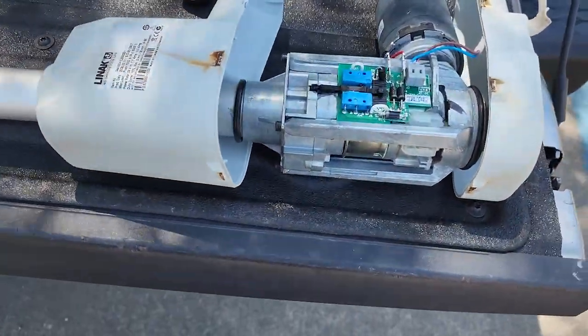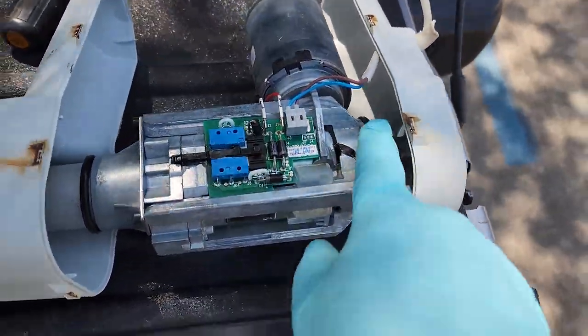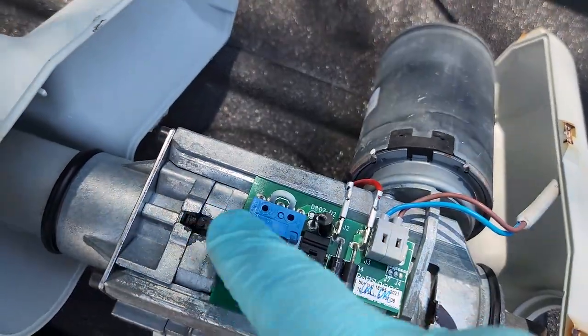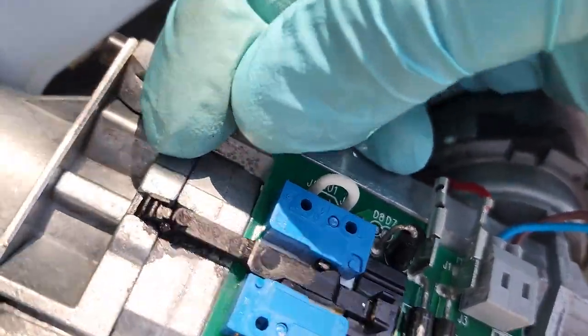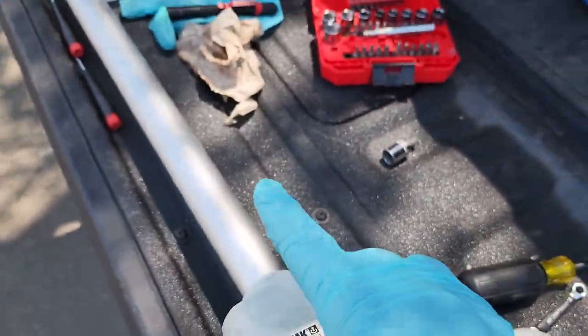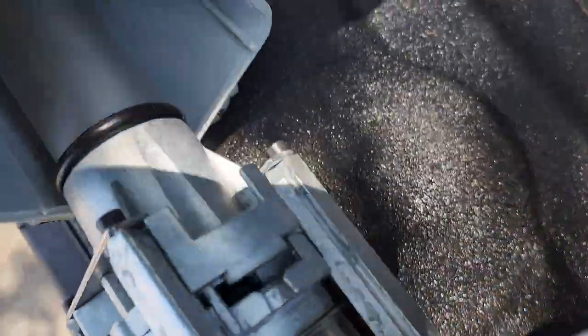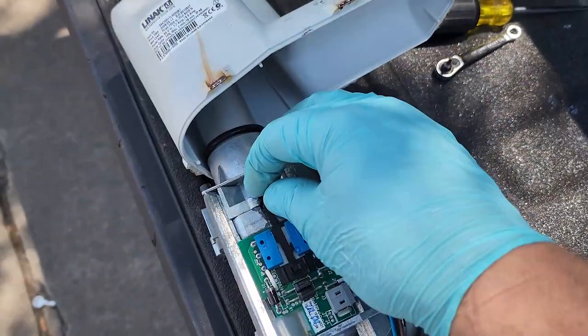All right guys, well, I tried separating the clamshell here, and as you can imagine, it's pressed together and there's a lot of dry seals in there, so that exactly didn't happen. But I was able to remove the little detector right here. I was able to pull it up. And there is a little tiny actuation piece right here. You can see it barely sticks up, and this piece kind of pops into it. I was able to get some lubricant down inside there, and it goes down the shaft. I don't know how far down, but I was able to inject some lubricant in there. There's a viewing window right here that gets you down into the gears and down to that shaft detect. I was able to get some lubricant down in there, and I was able to unfreeze it.